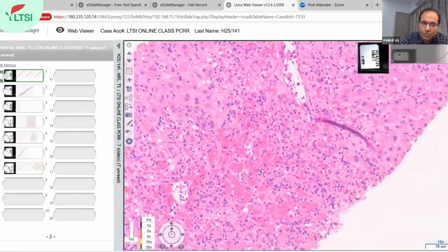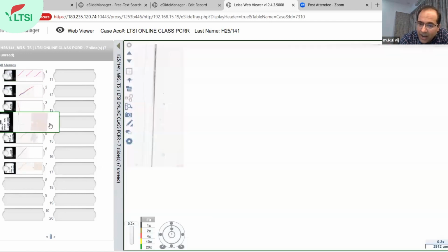Just to tell you one thing, apart from this, there are certain biomarkers also available which we can do on a biopsy. This plasma cell rejection is an unusual kind of rejection in which both humoral and cell-mediated components work together. So in this one, we can do C4d, which is negative, because they can have HLA-DQ or glutathione S-transferase T1 anti-GST-T1 antibodies. But we did IgG4 cells.